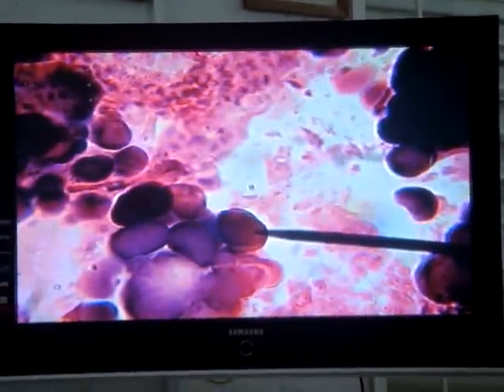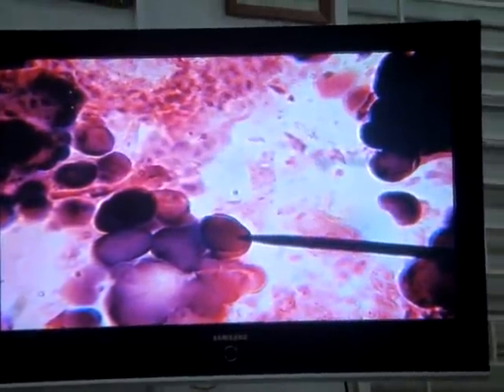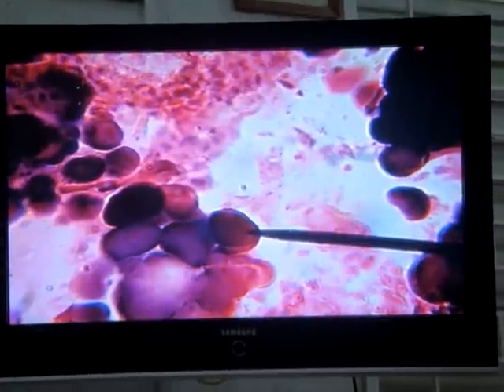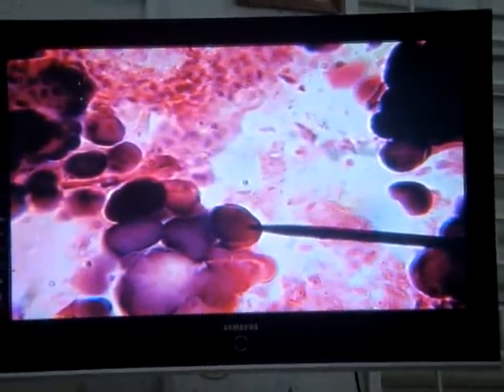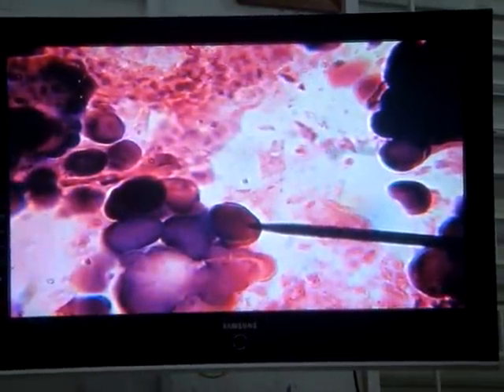With age, look at this now. With age, look what we find. With age, we find the accumulation of numerous concretions known as brain sands. Or you can call them by the correct name, corpora arenacea. If you can't spell that, just say brain sand. Brain sands.